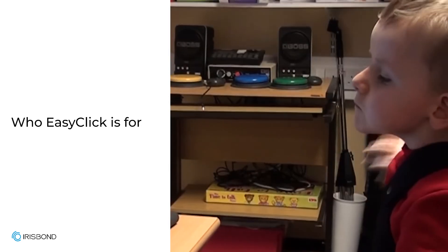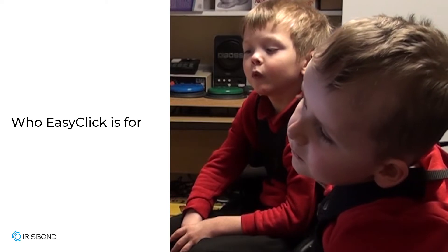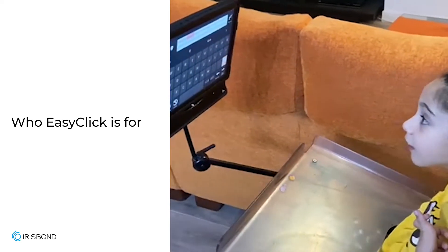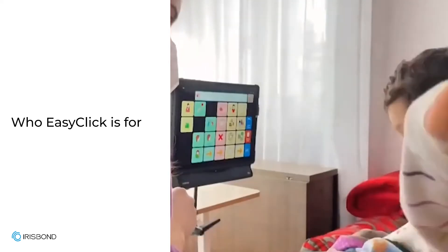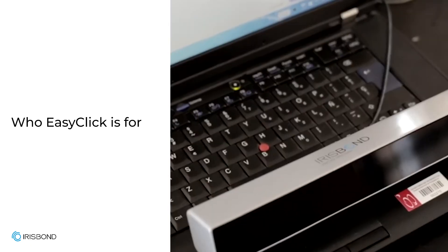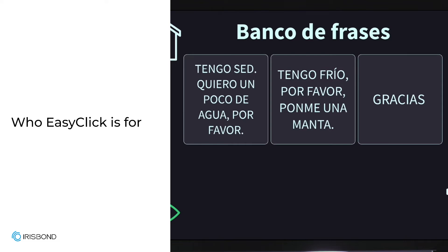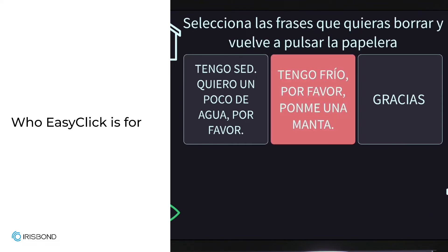People affected by mobility restrictions who cannot use a conventional mouse or touch system can use EasyClick with eye gaze. Eye gaze provides an alternative to a conventional mouse, making it possible to access an alternative communication path with the outside world. Combined with other augmentative and alternative communication systems, such as virtual keyboards, voice synthesizers, and environmental control systems, you can communicate, read, and write, or manage home environmental control through only eye gaze.